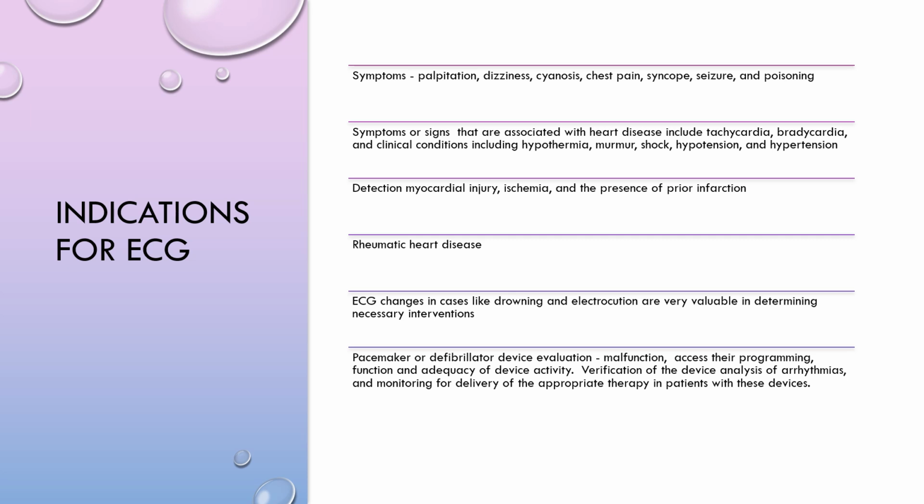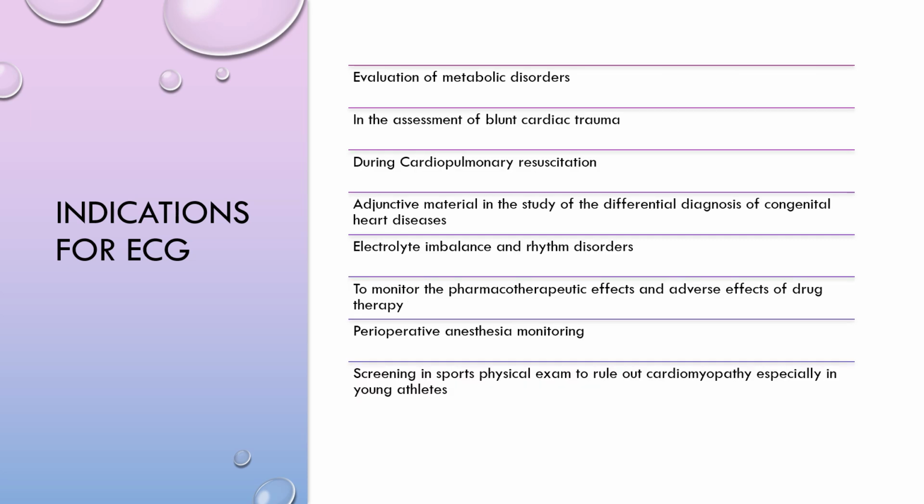For device therapy, we want to evaluate the device. Is it functioning well? What is the programming? We want to assess the programming. We want to look at the function and adequacy of the device activity. And we want to verify the device's analysis of the arrhythmia, and monitor for delivery of the appropriate therapy in patients wearing these devices.